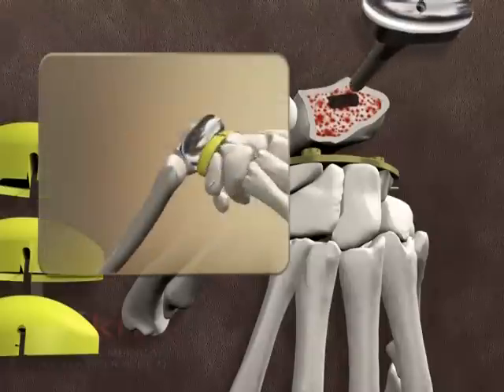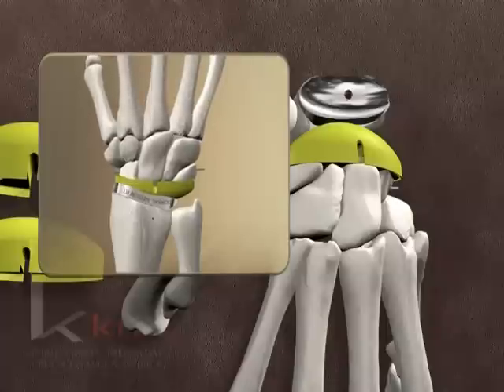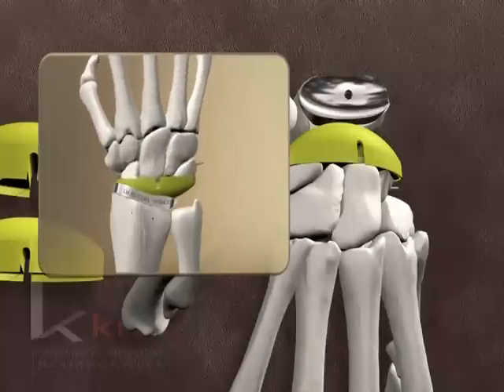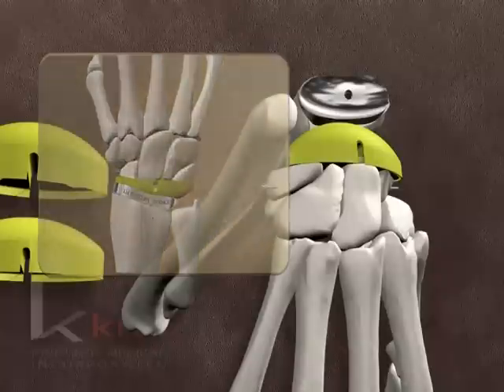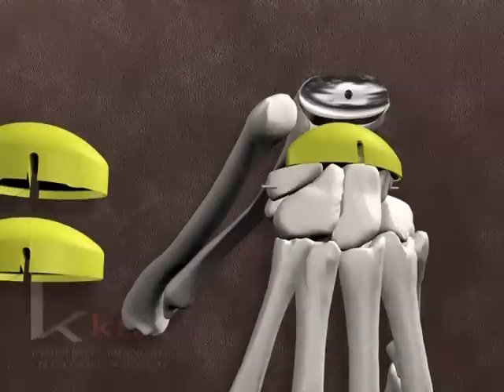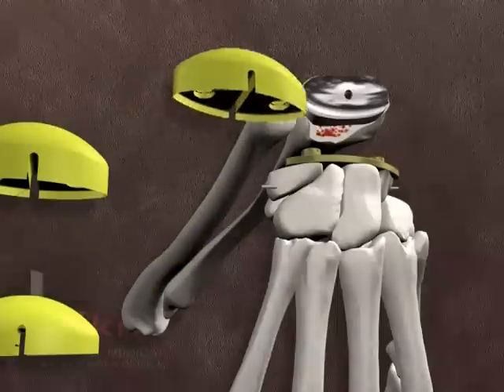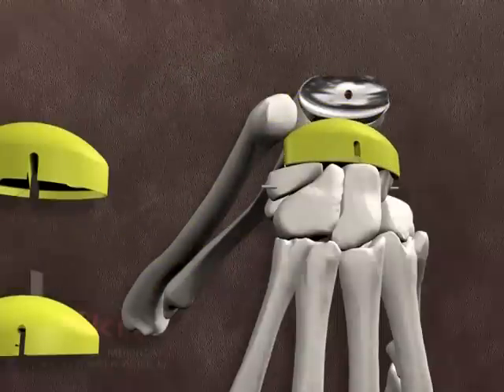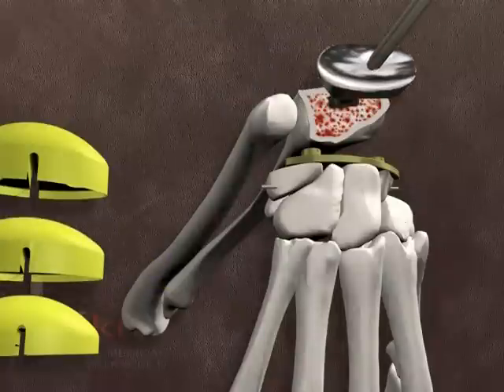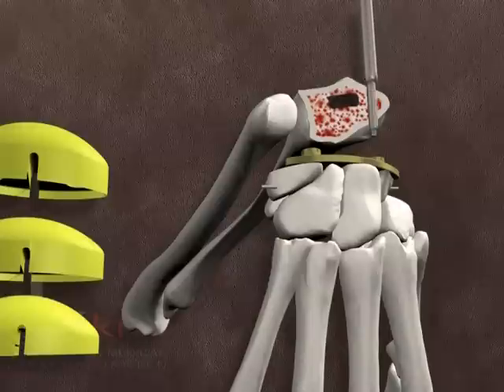The radial trial component is reinserted. A trial polyethylene carpal component is applied to the carpal plate. Beginning with the standard thickness, the prosthesis is reduced and range of motion and stability are checked. The prosthesis should demonstrate approximately 35 degrees of flexion and 35 degrees of extension with modest tightness at full extension. If the joint is unstable and the volar capsule is intact, a thicker polyethylene component may be required. A mild dorsal instability should respond to capsule closure, but a thicker polyethylene is considered for marked instability. Remove the trial components.